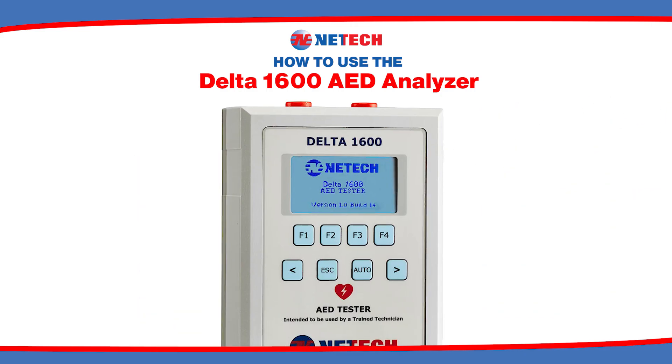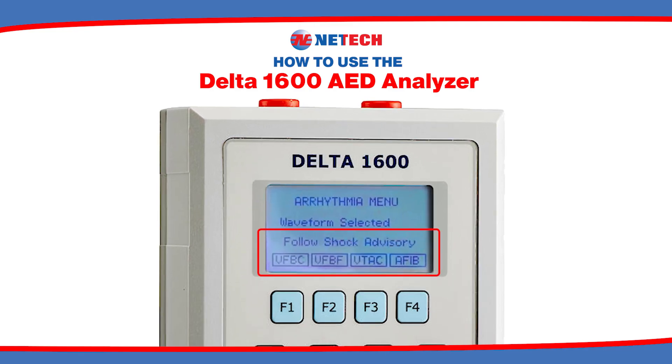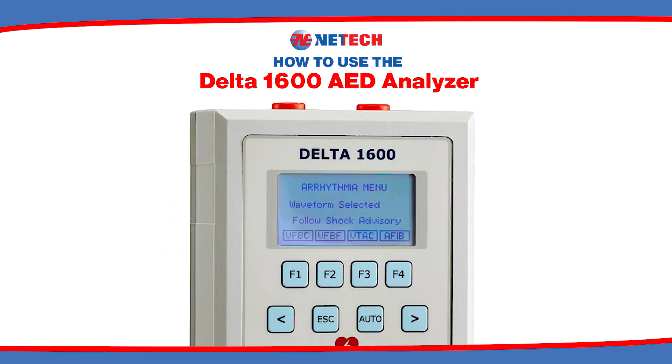Next, choose the arrhythmia option on the Delta 1600. Once the connection is established, push F1 from the main menu. On the arrhythmia menu, you will see the following selections available to choose from. Select the desired arrhythmia waveform by pushing any of the selection keys, F1 through F4.